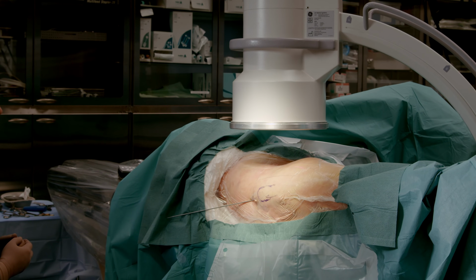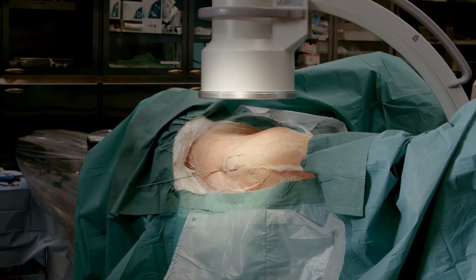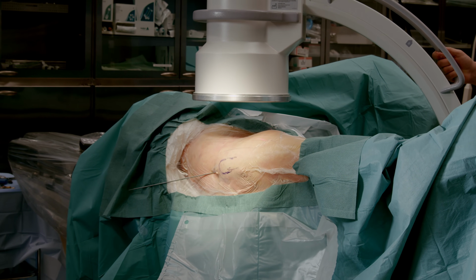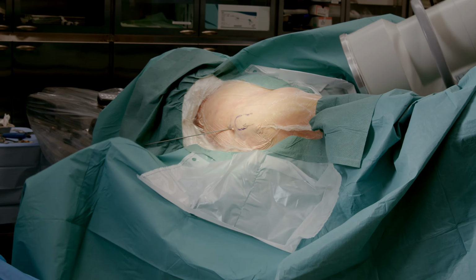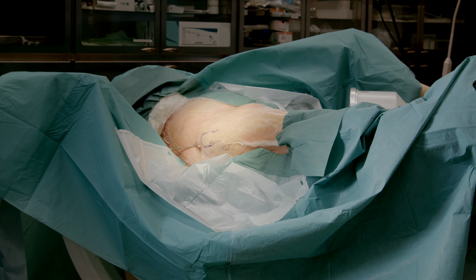We then advance the guide wire a little inwards. Now, after confirming the guide wire location in the AP view, we will take a lateral projection to make sure the wire is also in the right direction in relation to the femur in the lateral view. Remember to aim at the line between the anterior and the middle thirds. Now let's turn the C-arm around and take a lateral image.